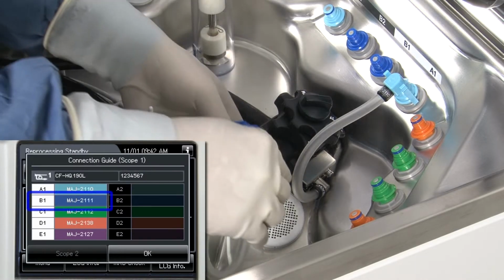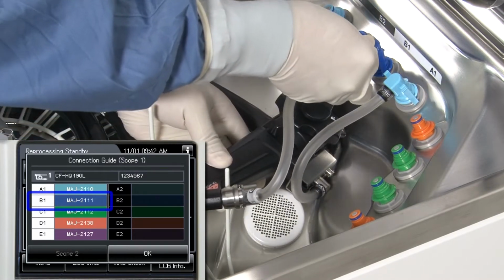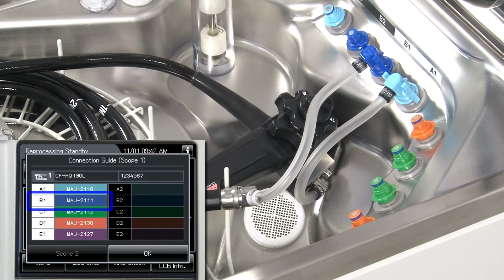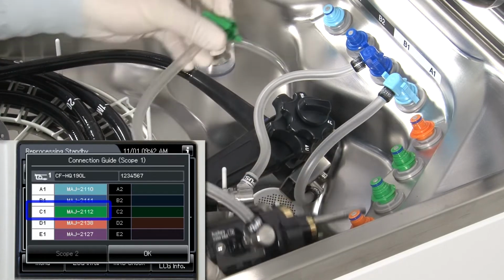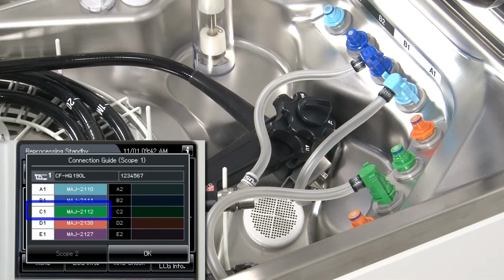Connecting tubes are attached to the OER ELITE by matching the colors and the number of the labels as instructed on the connection guide screen. If the connecting tube is connected to the wrong connector, for example, the connecting tube for the first endoscope is connected to the connector of the second endoscope, then channel blockage monitoring and channel connectivity monitoring cannot work properly.